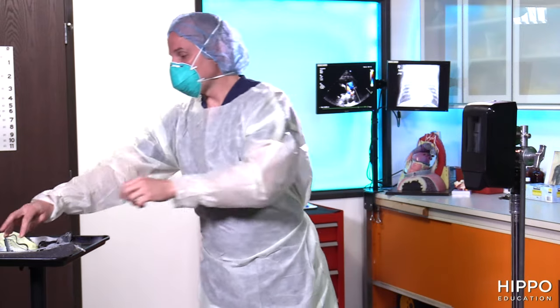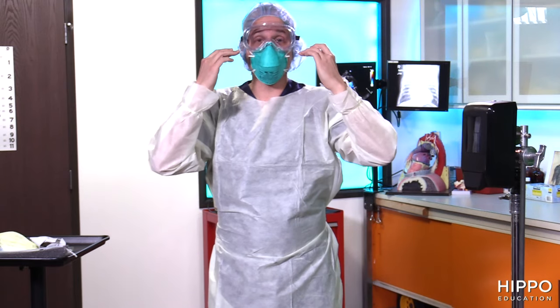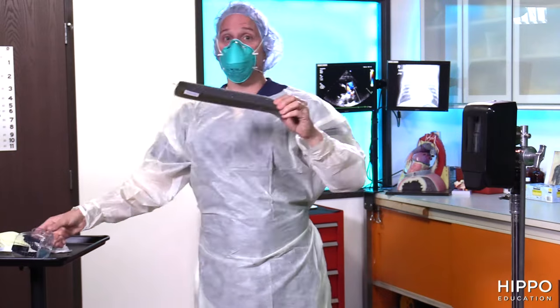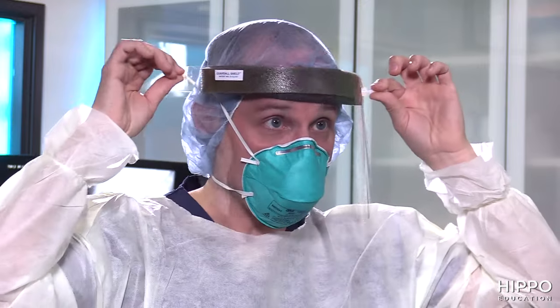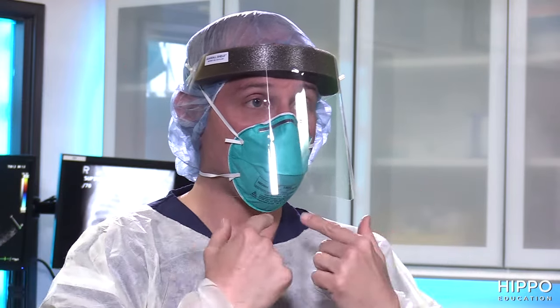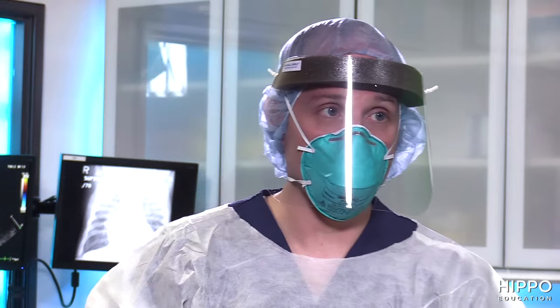The next step is the face shield or goggles. If you're wearing goggles, put them on and put the strap back — these need to go over glasses if you wear eyewear. With a face shield, the padding goes on the forehead, strap goes to the back, and you tighten it snug. The really important part is to make sure the face shield comes all the way down below the mask, protecting you from aerosolized particles or sputum coming from your patient.